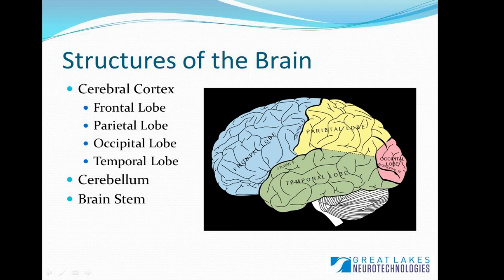So all four of these lobes within the cortex produce tons of information that we can record using the EEG. It provides a lot of important information about the electrical activity that's actually occurring in the brain while these areas of the brain perform their different functions.